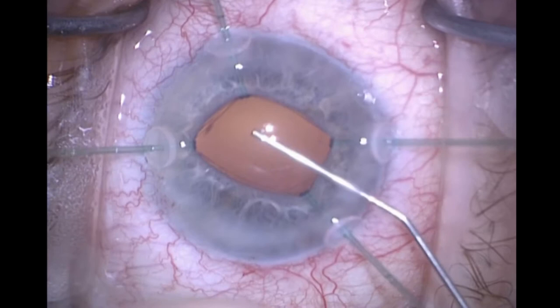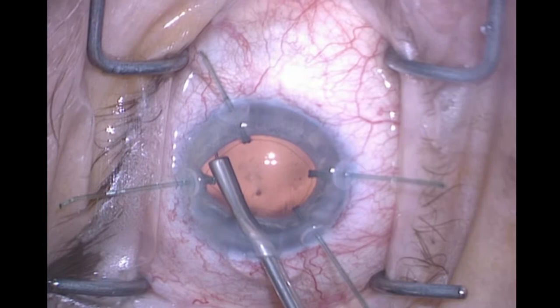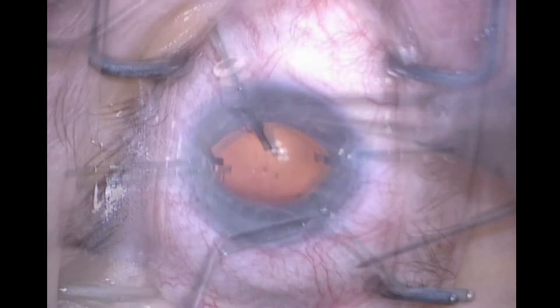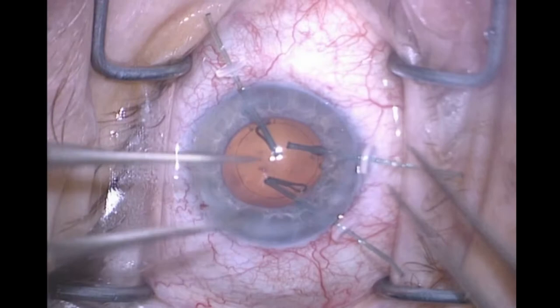We're going to put in the capsule tension ring now. I aim all the way to one side, and I do this while the capsule retractors are still in place, so we avoid displacing the capsular bag laterally with the opening of the ring. These disposable MST capsule retractors are then removed, just like with iris hooks.